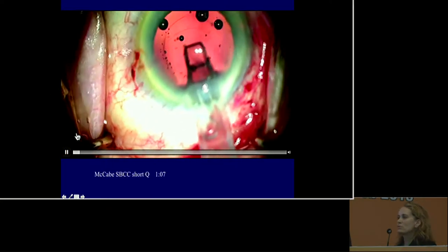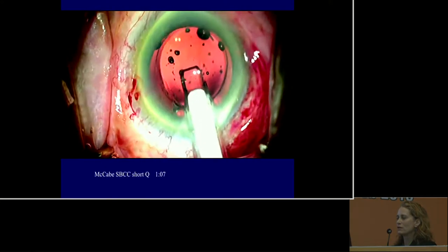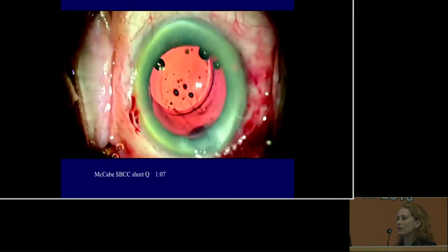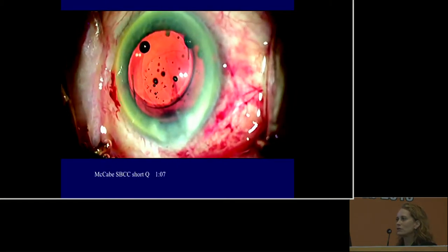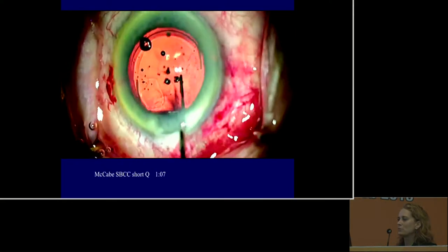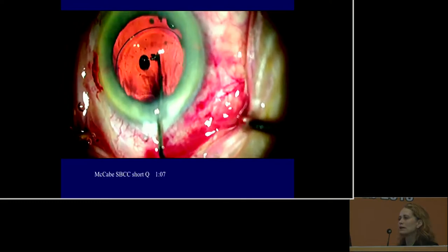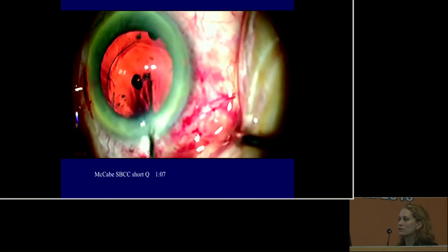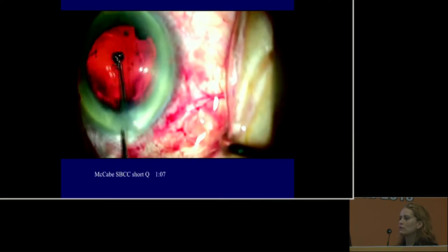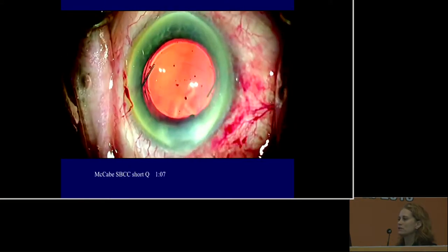This is one of the first cases of sulcus-based bi-capsular support. It's not a difficult technique to learn. Here, implanting a three-piece silicone lens — the BNL LI-61AO — slowly insinuating the two edges of the optic first behind the anterior capsulotomy, and then behind the posterior capsulotomy. It's a little more difficult to get through the posterior capsulotomy once the haptics are anterior, but not terribly. You walk the posterior capsulotomy around the edge, and you end up with a nice cat's-eye appearance of the capsular bags, confirming you are through both capsulotomies.